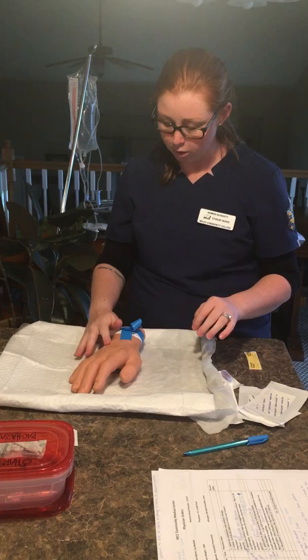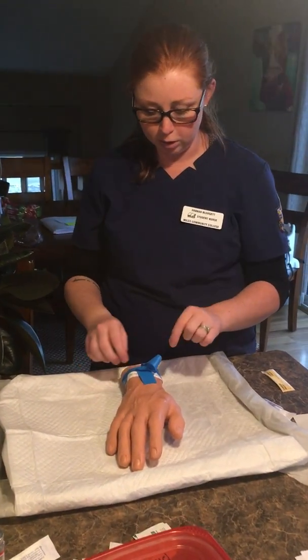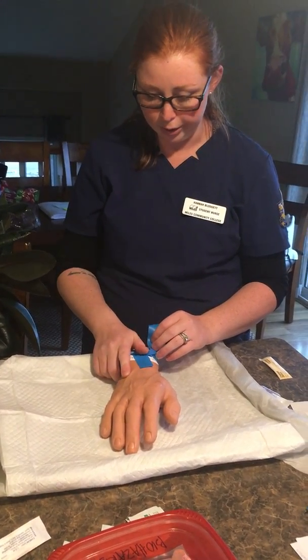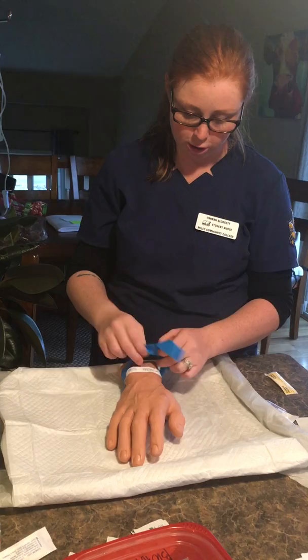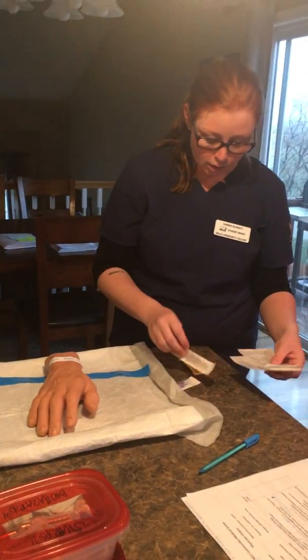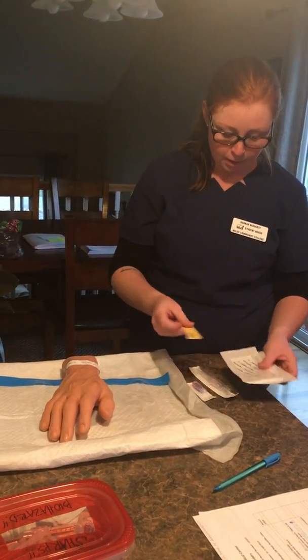So I found a really good vein right here. All looks really good to me. So I'm going to go ahead and make a mental note of that. And I'm going to undo the tourniquet while I gather my supplies. I'm going to be using a 20 gauge IV catheter needle.